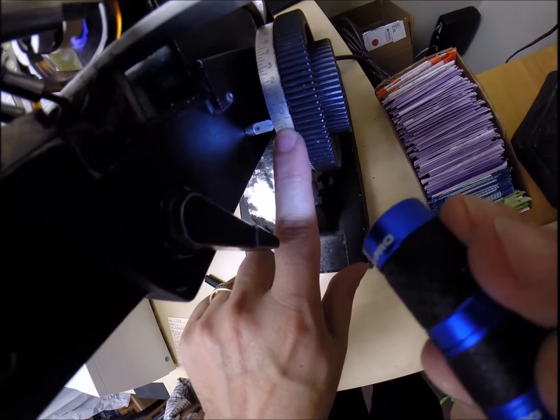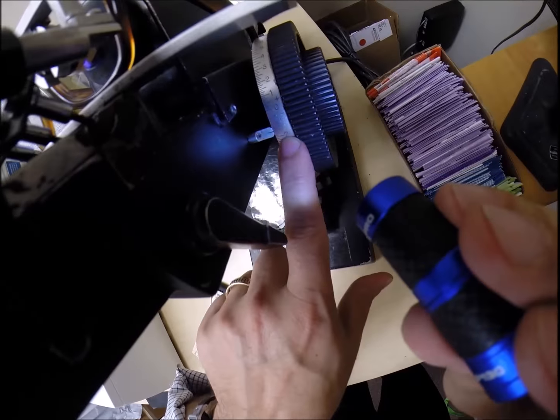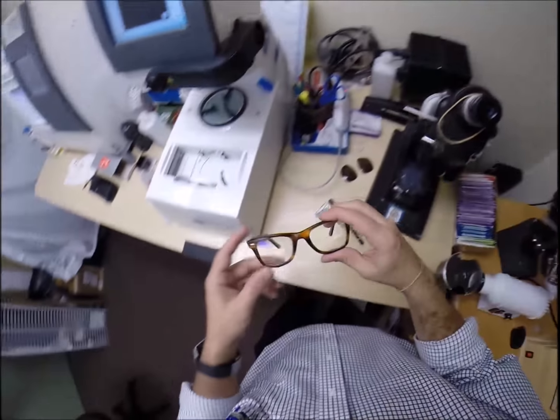minus 75. Again, one tick mark away from 1. If all goes well, we'll end up at minus 150. We're going to add 75 and 75 together. And we're getting 150, exactly halfway between 1 and 2. How about that? I couldn't have made that any better if I'd done it myself.